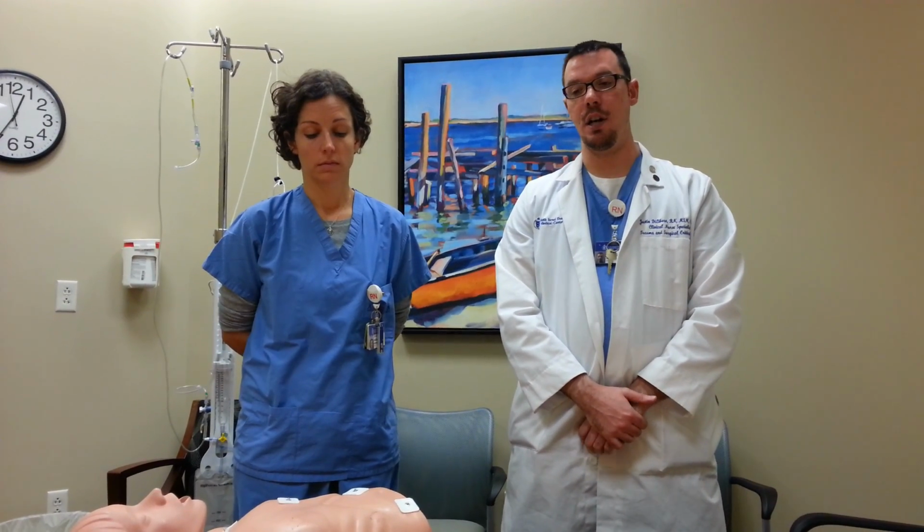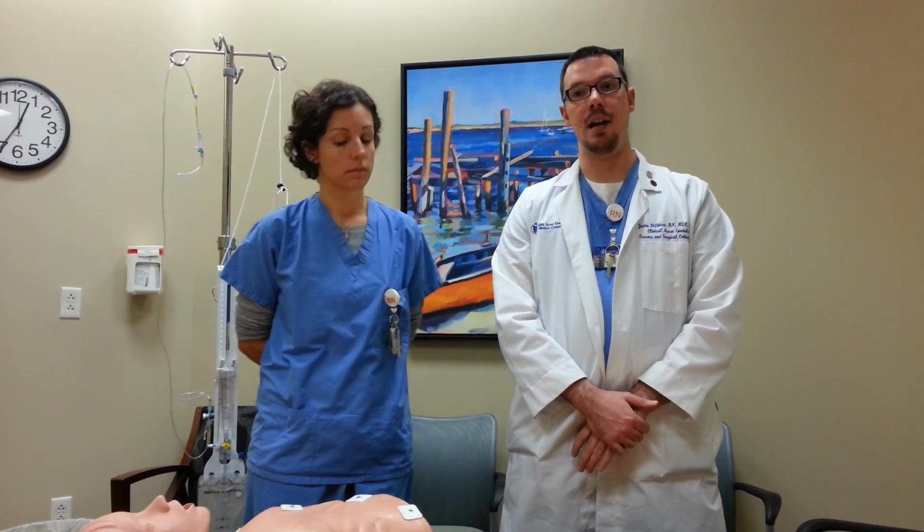Risk of overdrainage and underdrainage. If we overdrain CSF, then that can contribute to collapse of the ventricles, and then the brain tissue pulls away from the dura, leading to a subdural hematoma. Underdrainage obviously is important in that if we have patients with high ICPs and we want to drain CSF, if we don't drain enough CSF, then my ICPs will be higher than what we're aiming for. So what we're going to do is go through how to set up the devices and then talk about how these concepts relate to patient management.